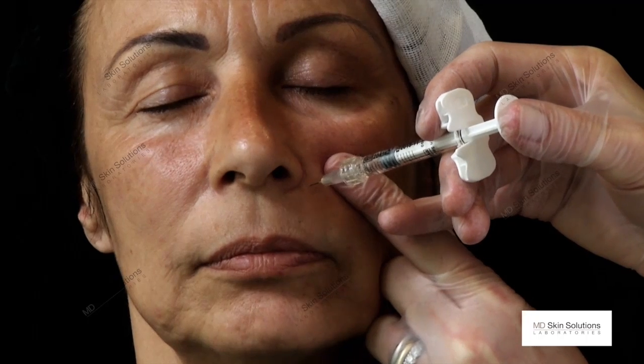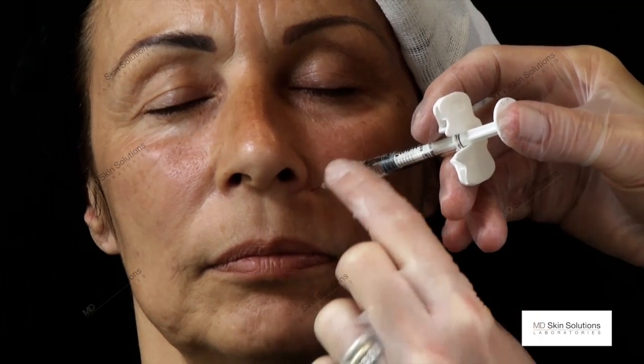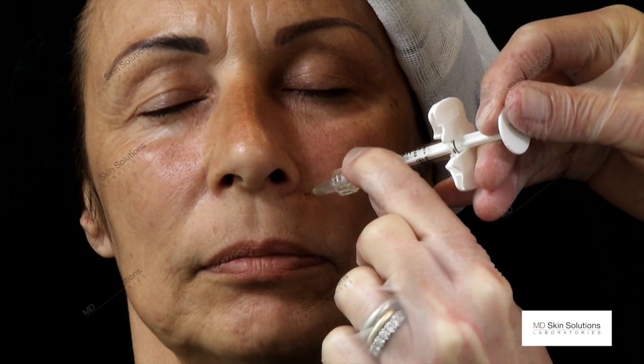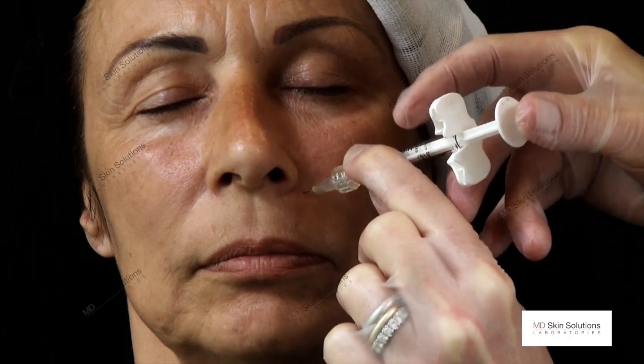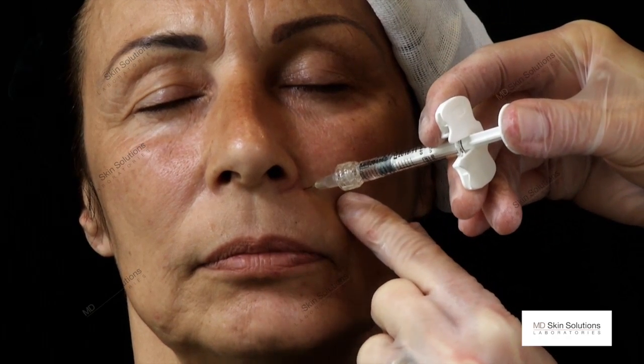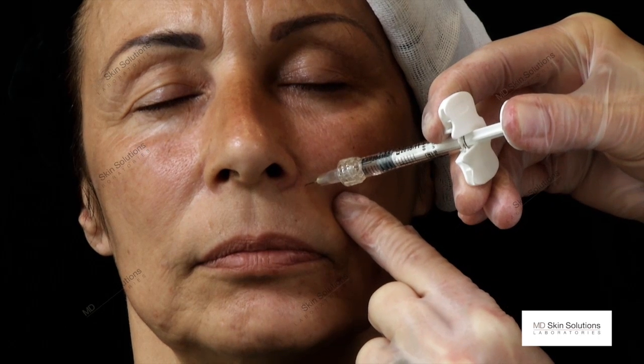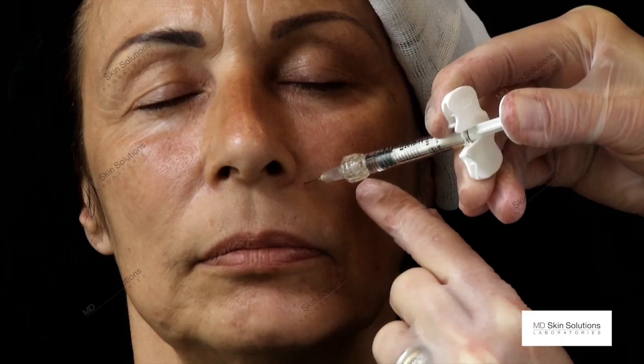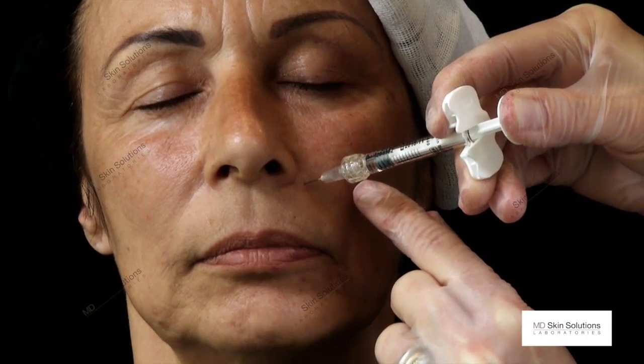I touch the bone, aspirate, touch the bone, withdraw the needle, aspirate, and then 0.1. See how it lifts up immediately.